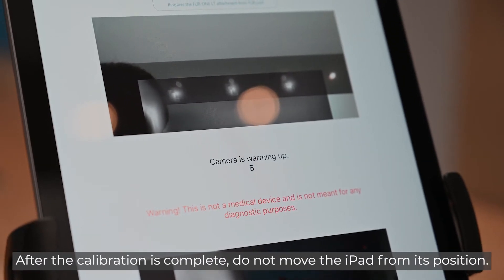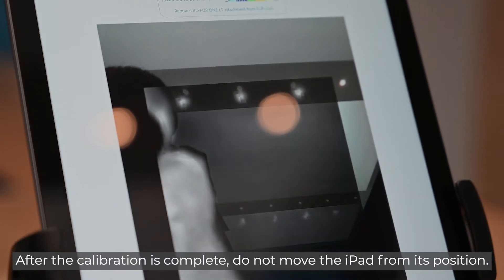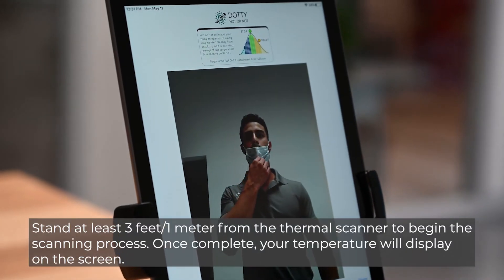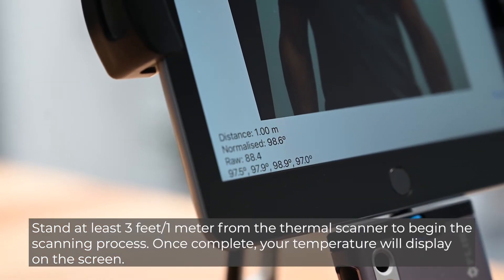After the calibration is complete, do not move the iPad from its position. Stand at least 3 feet (1 meter) away from the thermal scanner to begin the scanning process. Once complete, your temperature will display on the screen.